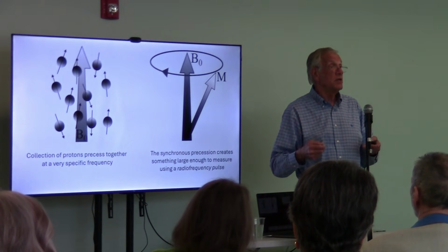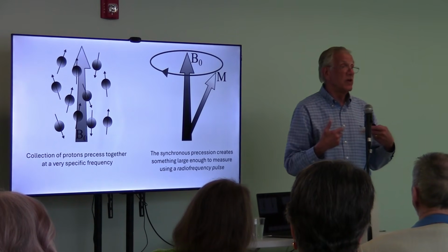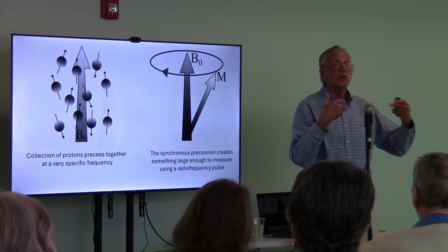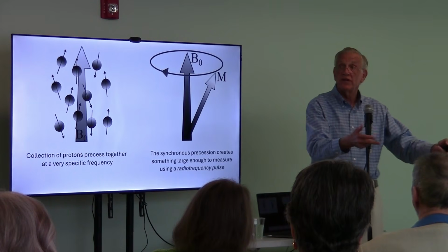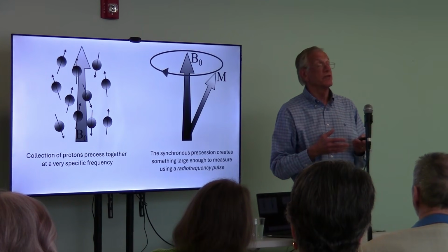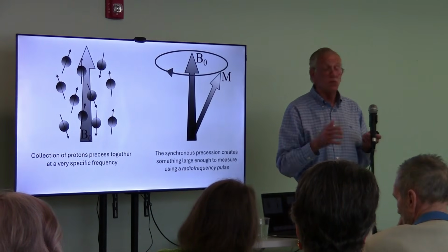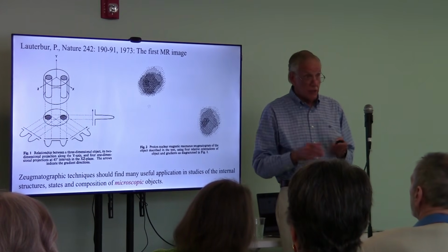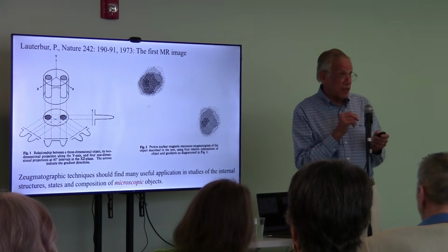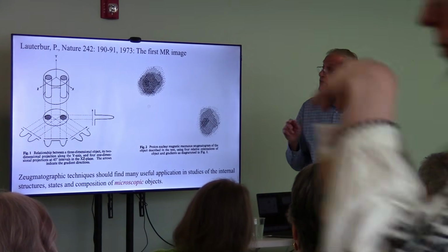So you're transmitting radio waves into the patient, and you're getting a radio wave out. The radio waves in do the excitation, and you then encode a whole bunch of different things about how that proton is interacting with its environment. So microscopy, we'll come to a little more in another 2 slides.